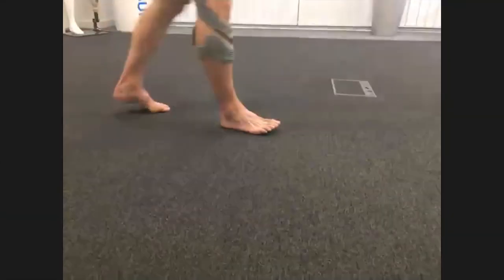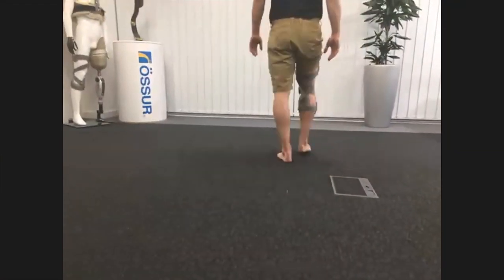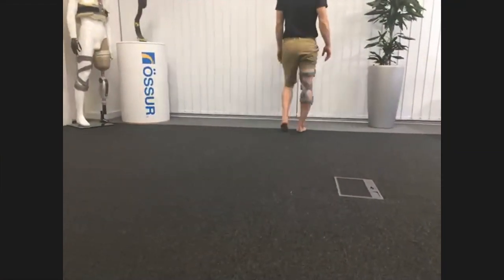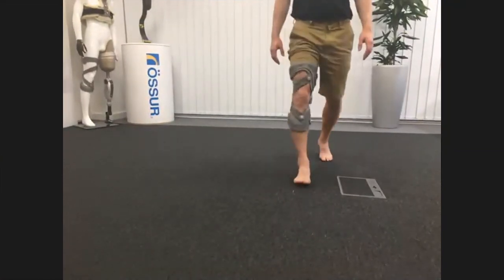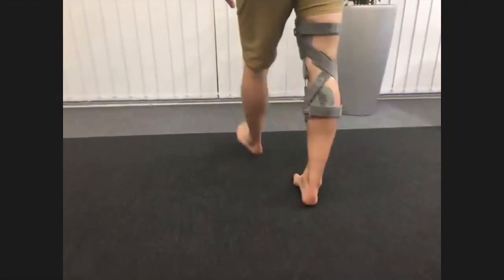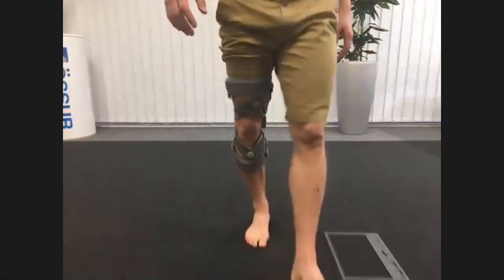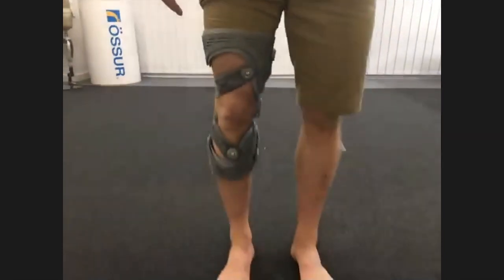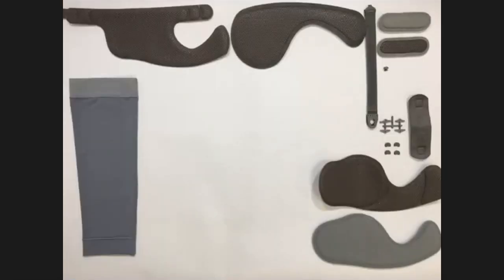With the brace fitted, we get Pete to stand and have a walk, looking at the mobile camera view. You can see that as Pete walks, the tension in the straps changes dynamically: when he flexes, the tension reduces in those dynamic force straps, in line with where the osteoarthritis is positioned within the knee. We've achieved a good normal fit and can now move on to discussing accessories for the unloader.